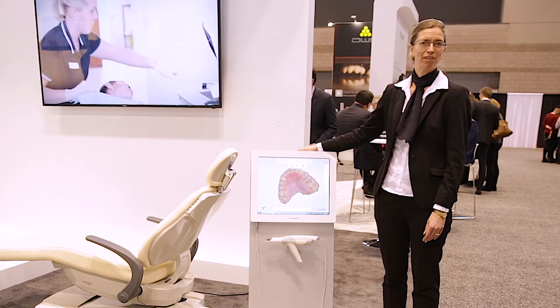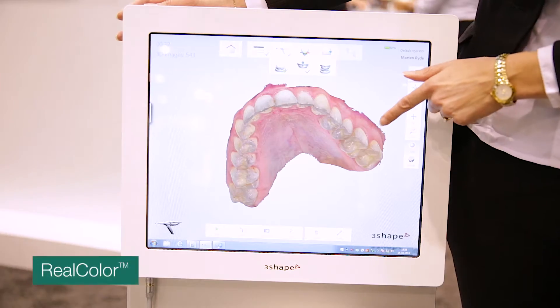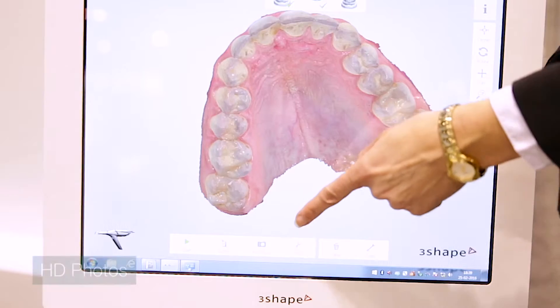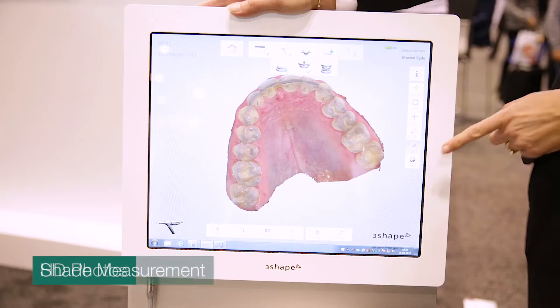Last year we launched a great product with Trios 3, with the real color scans, the fast and easy scan, and the HD photo and the shade measurement.